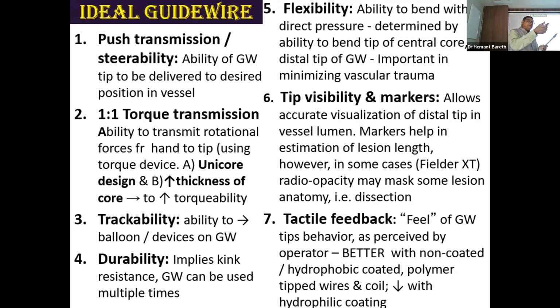But durability is also whether you can change back the shape of the tip. If it is possible to do that, then it is a durable guide wire. But some of the wires, if you make a bend and then you are unable to straighten them, are not durable guide wires. An example is BMW. If you once make a tip on the BMW, it is nearly impossible to get it back to normal and make another kind of tip. So this is what is meant by durability.